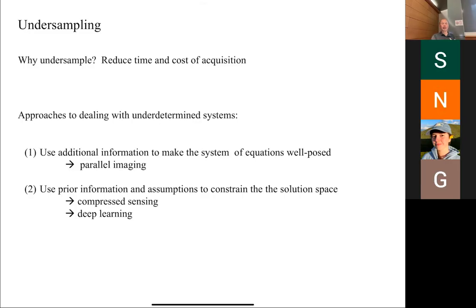And so ideally, there are some places that are trying to aim for like a 15-minute exam, okay, or even a 10-minute exam. Like literally the limiting factor is no longer the MRI system. It's actually putting the subject into the scanner and getting them off, right? Especially people who are sick, it can take some time to actually put them on the scanner. So in hospitals where they're really trying to get throughput, they actually have beds where they'll load the patient in beforehand, and then you save that time where you can just load the bed in and you have multiple beds and you just have them in a queue waiting to go through the scanner. Okay. So for people who are trying to run MRI as a business, undersampling is a way to make more money.